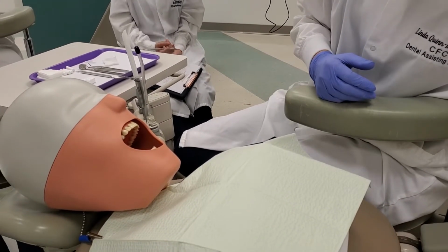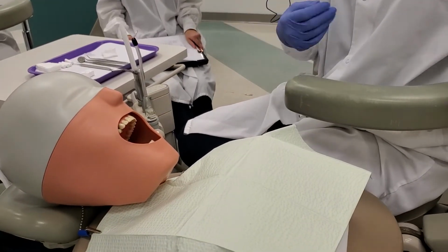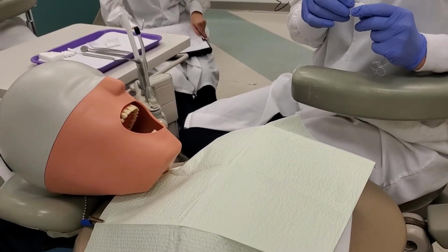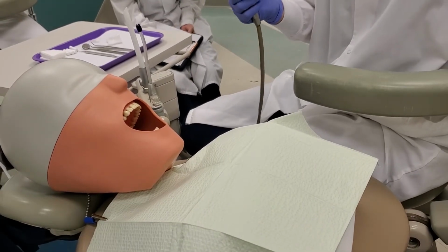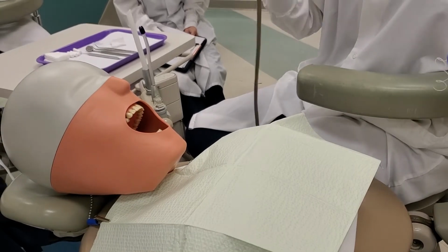All right, so now we're on page 30. Number 2, use the bite block. Okay, so you have your bite block. You're going to place the air water syringe in your right hand, because your bite block is going in your left hand. With the left hand, place the bite block in the mouth and remove. So you're using this to retract.